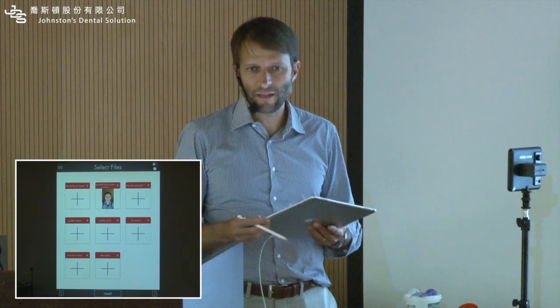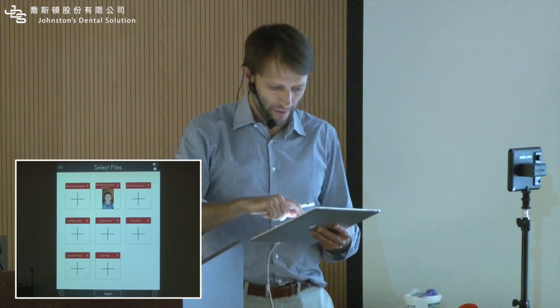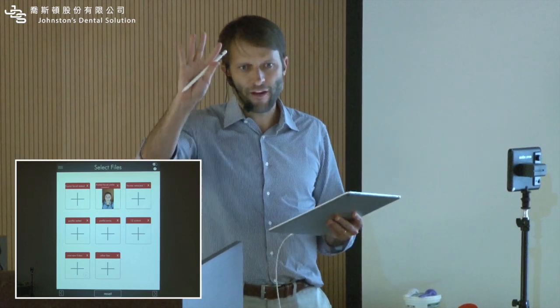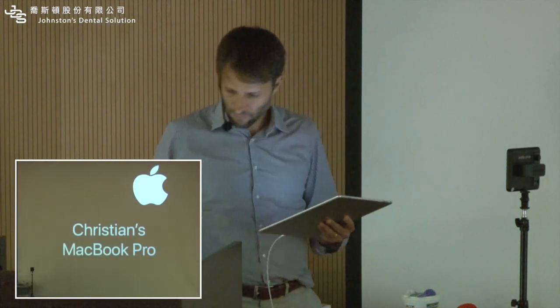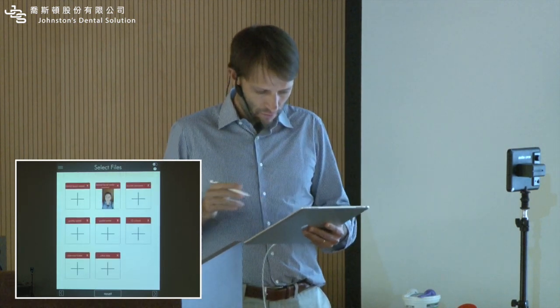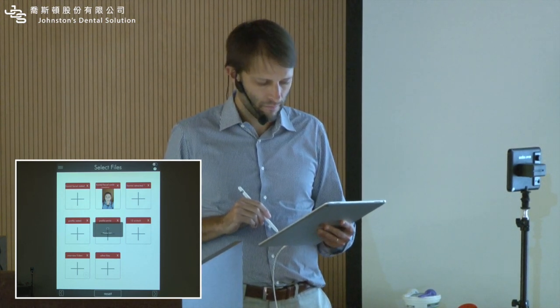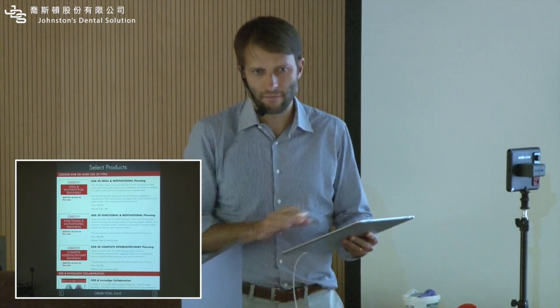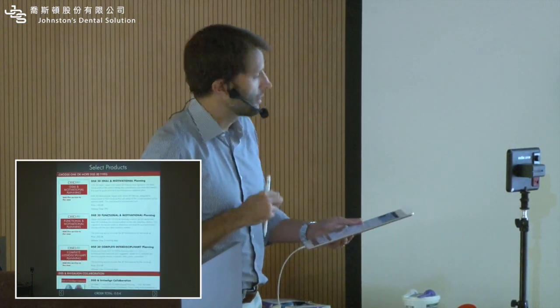We can add more files. So let's say we did an intraoral scan. We did the rest of the photography. So now I'm filling up the whole with any kind of information I want. The more the better. 5 pictures, 1 video, and the STL is the minimum. But if you have more info, just share the info. Okay? So now I just click next, and there we go. The planning center. Okay? This is Madrid. This is us. And then you can go over everything, whatever you want.